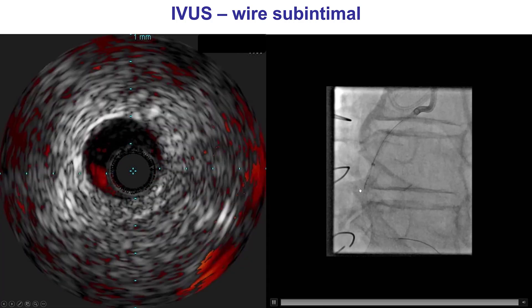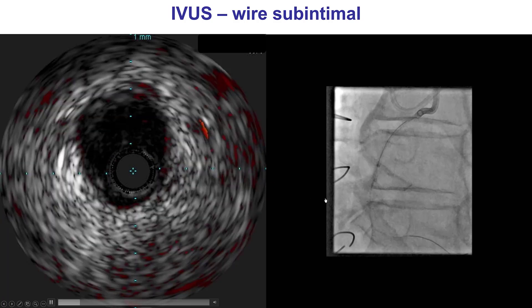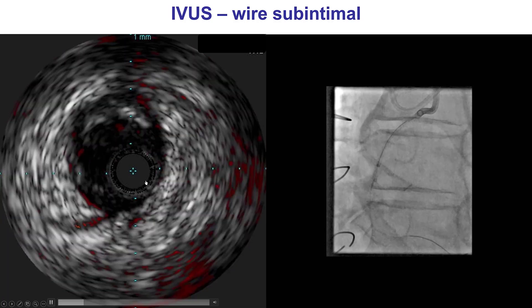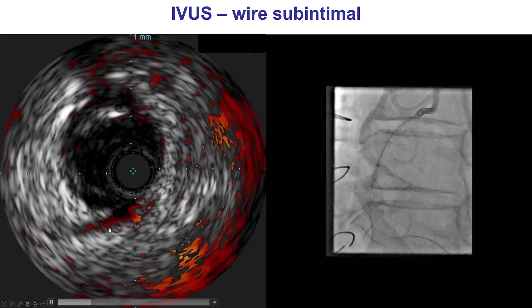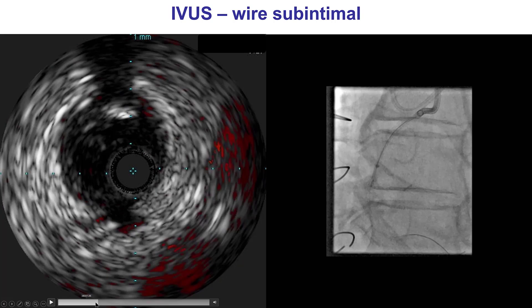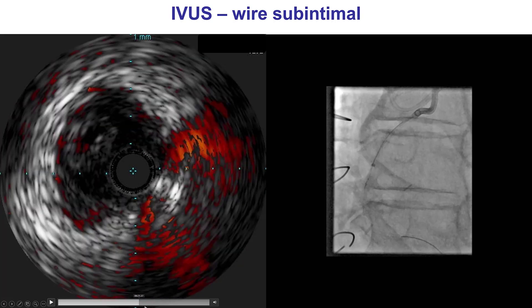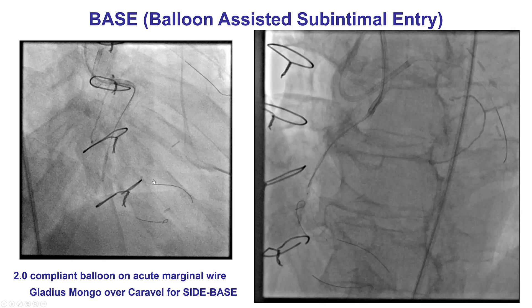We then did intravascular ultrasound that demonstrated that the wire was subintimal. We did have quite some subintimal hematoma into the mid-right coronary artery. Here is the true lumen compressed, and this is the subintimal space that we have created in the mid-RCA.